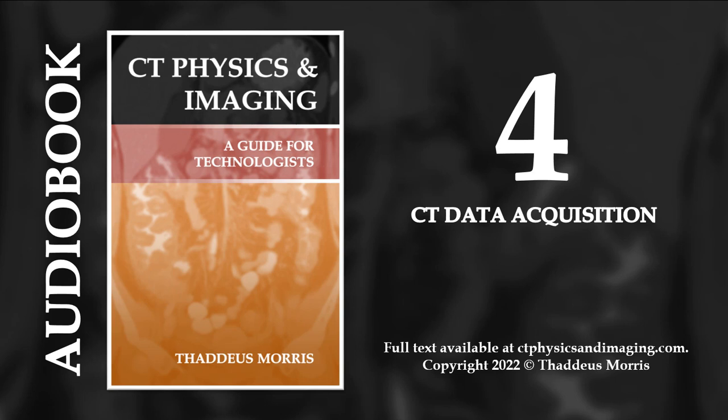The 3 CT imaging dimensions are the x-axis, y-axis, and the z-axis. The x-axis, or x-plane, extends horizontally across the scanner, representing data coordinates in terms of right and left. The y-axis, or y-plane, extends vertically across the scanner, representing data coordinates in terms of anterior and posterior. The z-axis, or z-plane, extends longitudinally through the scanner, representing data coordinates in terms of superior and inferior.